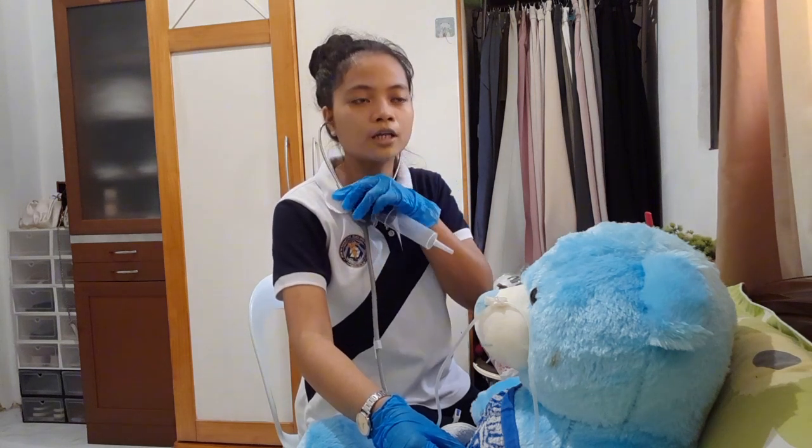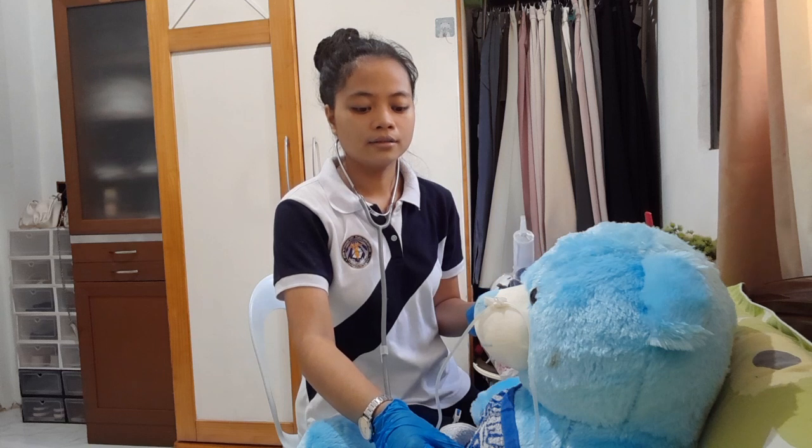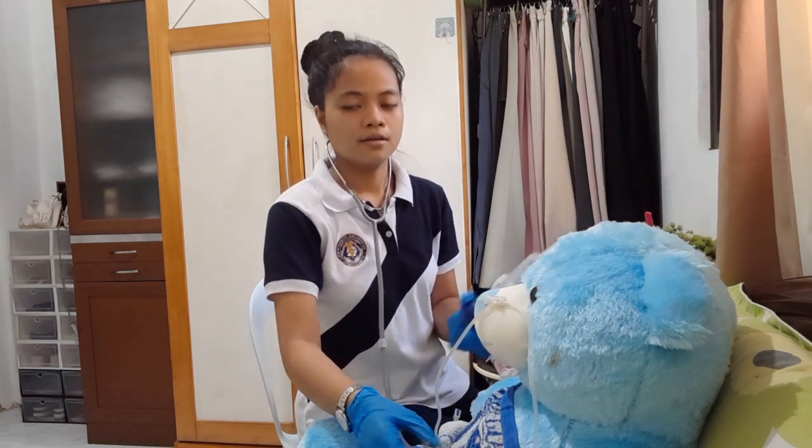So, maximum amount of air to instill. So, for adult, 10 to 20 ml. For child, 5 to 10 ml. For neonate, 1 to 2 ml. Then, this is only sa correct placement. Pwede din yung by through x-ray.